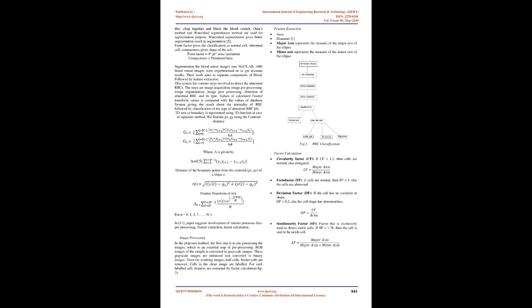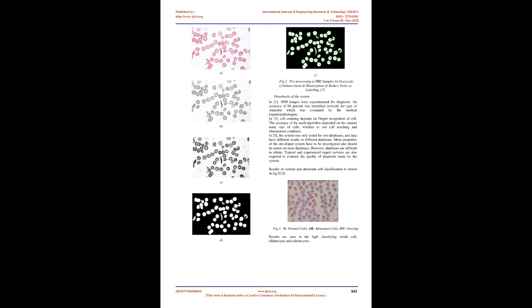A low-cost disease diagnosis method is implemented that uses RBC and WBC cell structure. Cell structure determination is done by Hough transform algorithm, whose purpose is to find imperfect shape of RBCs within the smear sample. Hough transform has been extended to find arbitrary shapes, mostly circles or ellipses. In this paper, they have used Sobel algorithm for segmentation. Background is separated from the object. K-means clustering is used for database comparisons.